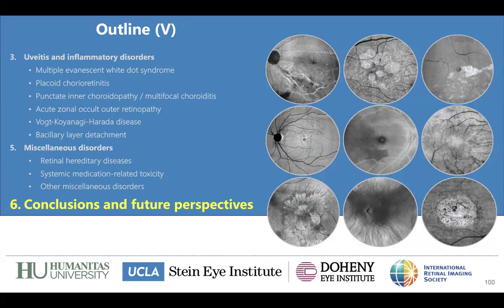There are some ways of analyzing the lowest point of reflectance for each map, and we have a few papers studying this kind of en face image, and for me, it's very interesting. Do you have experience or thoughts about this kind of imaging?